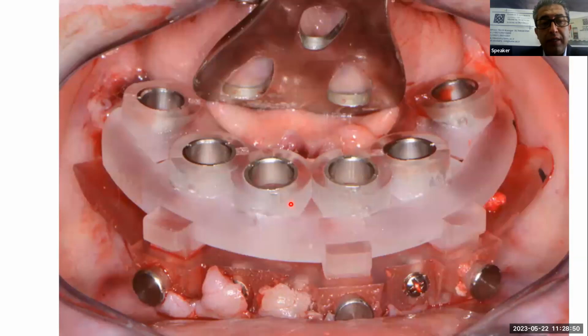The third one is the bone-supported surgical guide. It needs a big incision, a huge exposure. This kind of surgical guide is used in patients who need, for example, different techniques of bone grafting, doesn't matter, GBR, ridge splitting, sinus lifting. And compared with the two previously mentioned surgical guides, it is much more aggressive. That's why most surgeons prefer to avoid such guides.